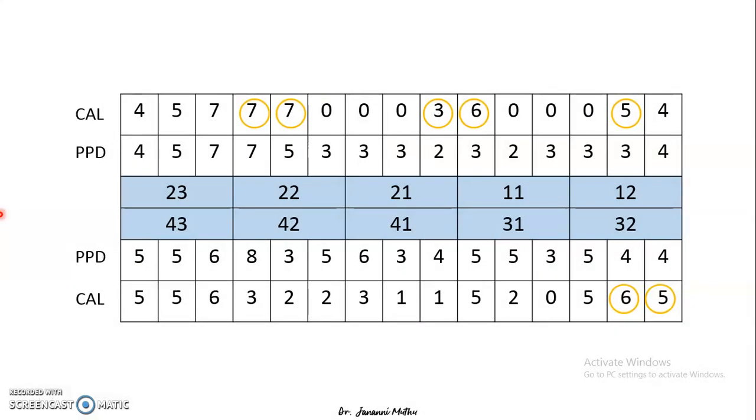Secondly, all these teeth where CAL is indicated by yellow circles, you can see that the value of CAL is greater than the value of the PPD, which means all these teeth have recession. The margin of the gingiva is apical to CEJ. In this chart where the values are indicated by blue circles, all the value of CAL is lesser than that of the PPD, which means in all these teeth, the marginal gingiva is coronal to CEJ, indicative of gingival enlargements.